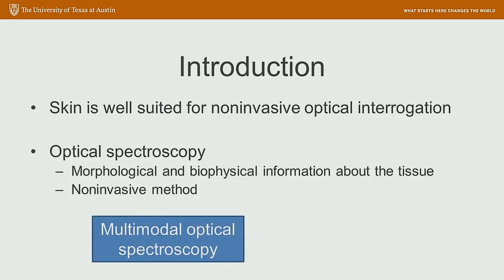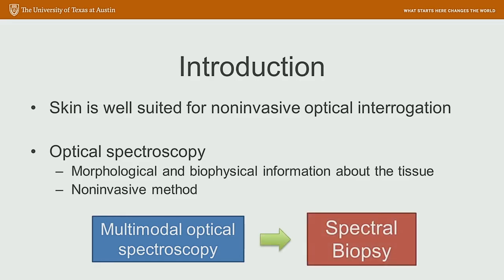So our group utilizes multimodal optical spectroscopy, so a few different forms of optical spectroscopy. What we aim to do is to use multimodal optical spectroscopy to give what we call a spectral biopsy of a suspicious lesion.